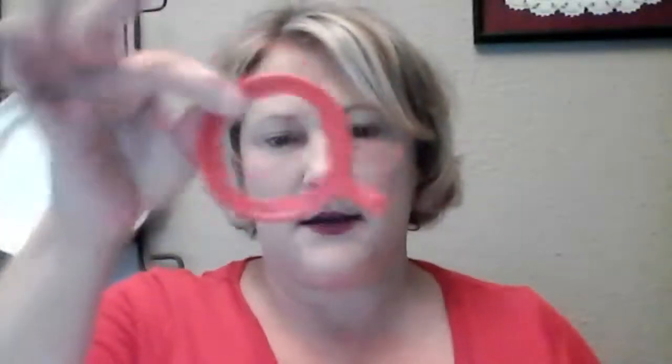Film or sensor holding instruments. Do you see this little guy? It comes in red, yellow, and blue. Follow along with me. Go ahead and turn to page 220 so you can get an actual visual of what it looks like.